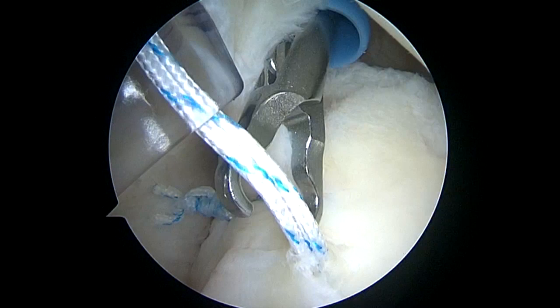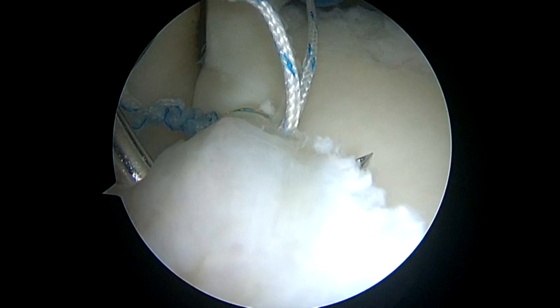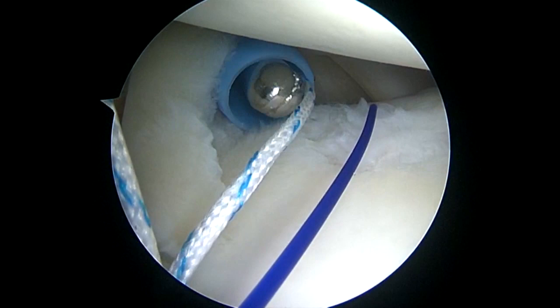Again, we're going to manage the sutures through the anterior portal. I'm going to grasp the suture that I want to pass through the labrum. I'm using a reusable suture passer, but you can use any device that you want. The reusable passer with the OPDS is very cost effective in a surgery center.